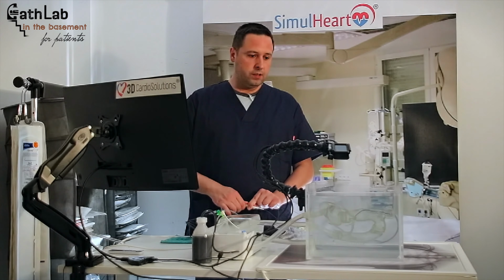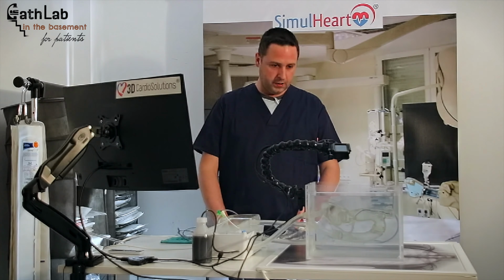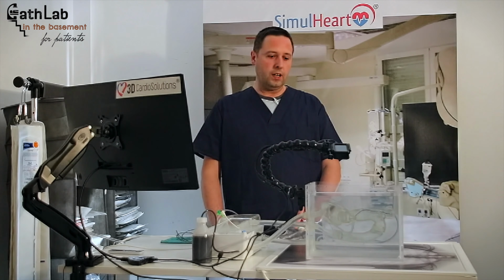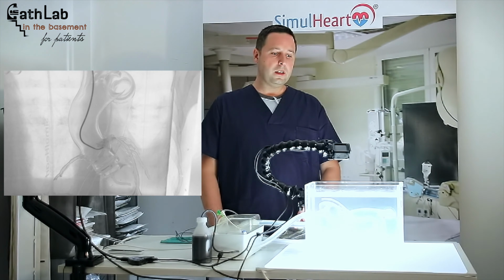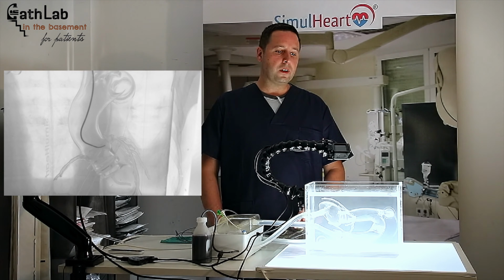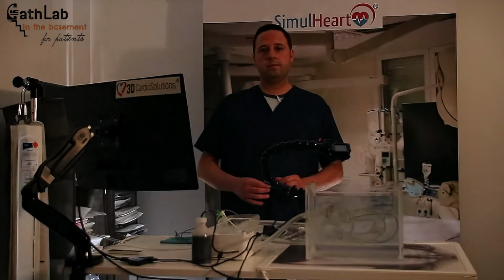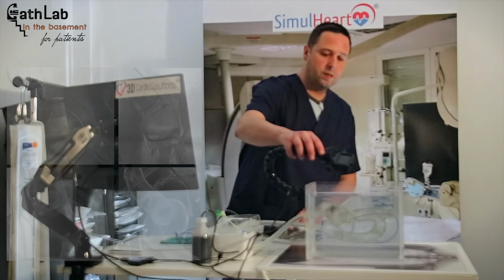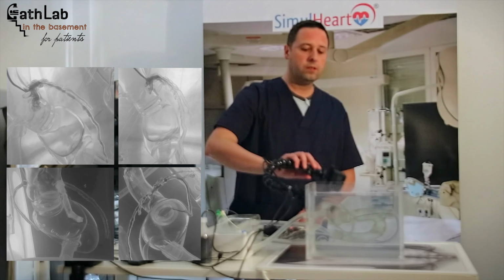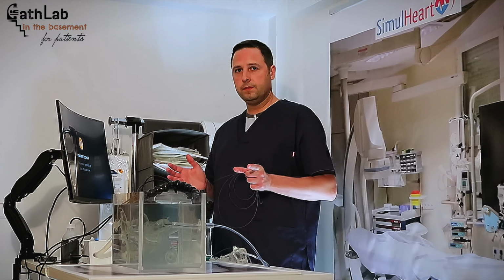So when we get to the artery, we have to manipulate the catheter to get it inside the coronary artery, and then we can give contrast and see the anatomy. And we have to do several projections in order to get a good look at the coronary arteries and to tell you if there is any coronary artery disease that needs treatment or not.